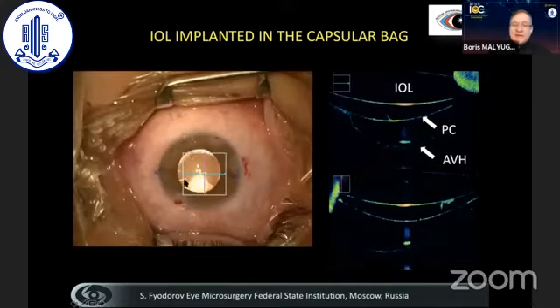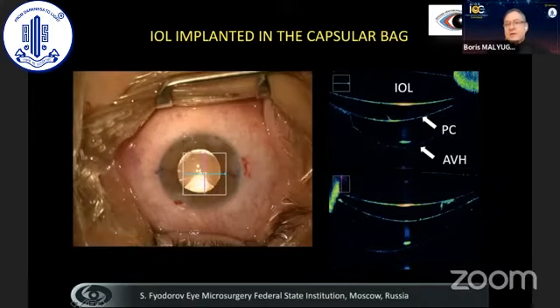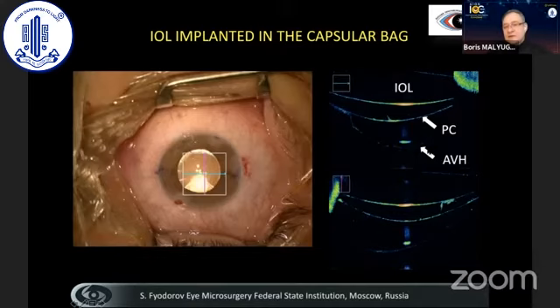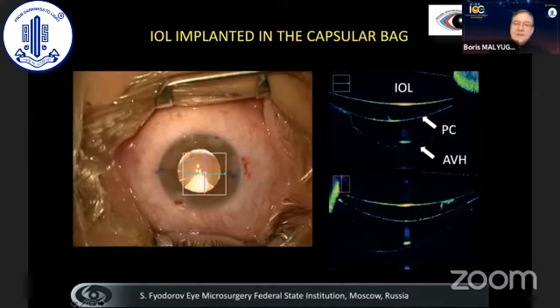This is a patient after radial keratotomy, which you can see by the scars. We know that in these cases the zonules are usually weaker. The IOL is in the bag, the posterior capsule has some cortical remnants, and the anterior vitreous hyaloid is detached. We see that there is still an adhesion in the mid-periphery of the posterior capsule, which holds contact between the posterior capsule and the anterior hyaloid.